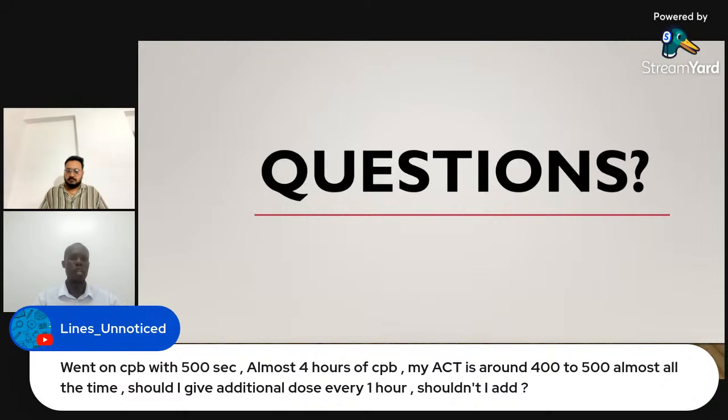So the answer is I should add. Yes, but I think we should prefer maintaining the ACT around 500 to 600, because the minimum ACT we maintain is 480. So it should be between 500 and 600. That is the safe thing on CPB. Thank you.